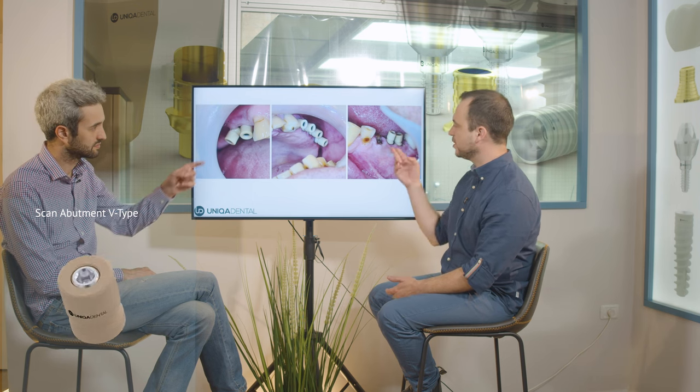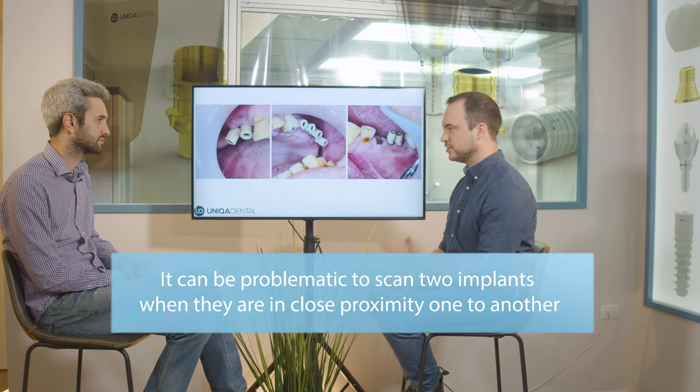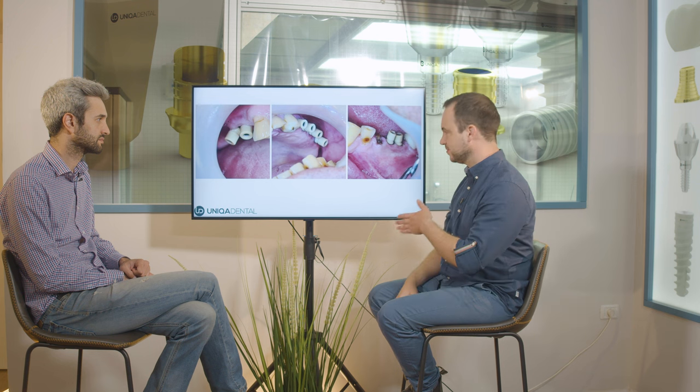You can see the scan abutments — all of them fitted perfectly except those two. These are the interesting ones, because when you have very close proximity between two implants, you can't just fit the scan abutments. You'll have the same problem with transfers, whether open tray or closed tray. So what we did is we took part of the scan abutment out — we cut the scan abutment. We scanned with one full scan abutment and one that we cut: roughly one-fourth of the scan abutment was removed. And still in the modeling program — Exocad 3Shape — you can use this scan abutment and it will work fine.